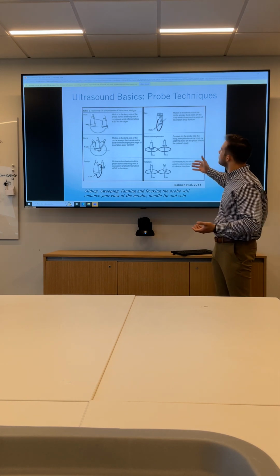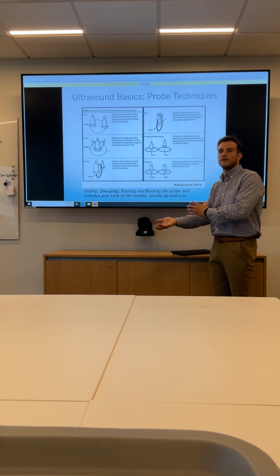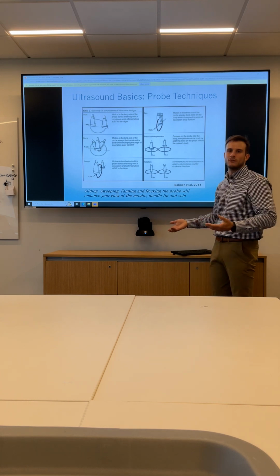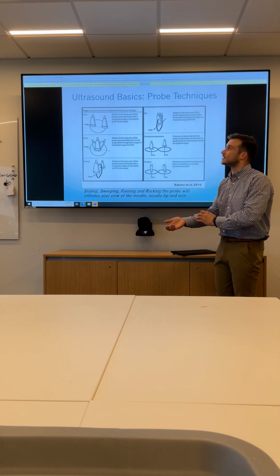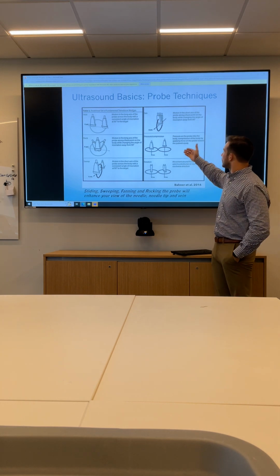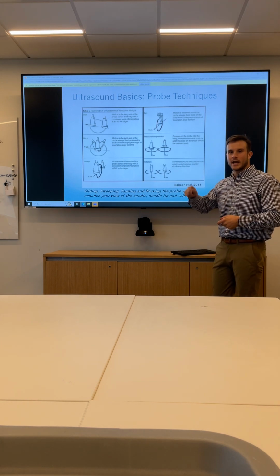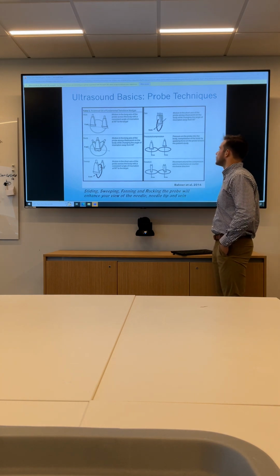And then there's fanning, not overly important, but it is important, a little bit more of a higher skill level technique, tilting it along that x-axis, front to back. Again, that can give you a little bit more of an image. Sometimes the gel in the gel probe can bunch up to one side, and by fanning it up and back, you can actually get a better image. Pressure and compression, very important, again, for differentiating between an artery, vein, or nerve, but mostly for the artery and vein. It's push down and compress. That's crucial for differentiating between the vein and artery.